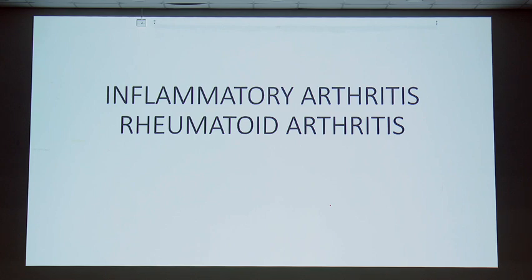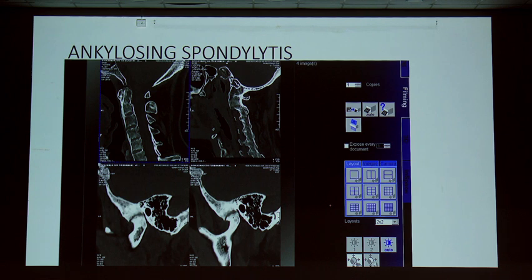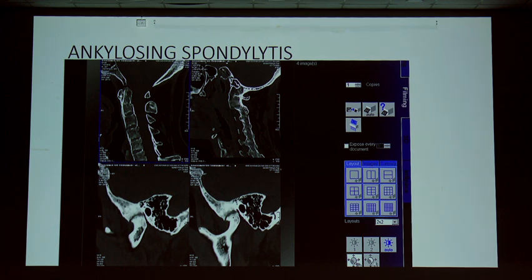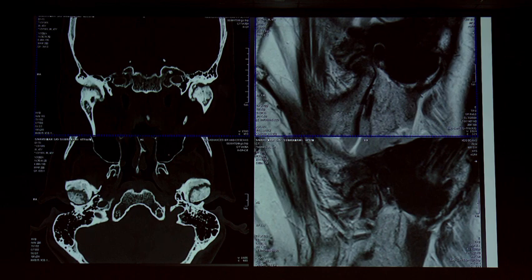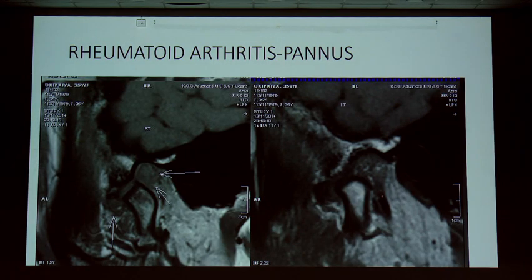Rheumatoid arthritis and ankylosing spondylitis can involve the TM joint. A patient with ankylosing spondylitis may have bamboo spine, facet joint involvement, atlantoaxial joint involvement, and TM joint involvement with almost no disc — near complete bony ankylosis and sclerosis. On coronal sections, MRI beautifully demonstrates bony ankylosis and thick fibrosis in the TM joint. Twenty-five percent of ankylosing spondylitis patients suffer from TM joint involvement.